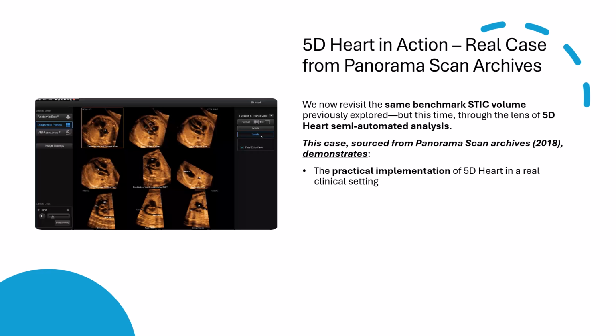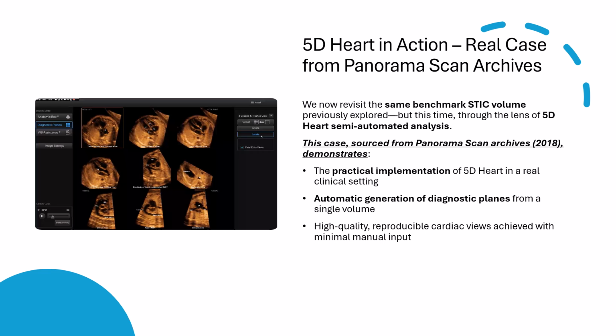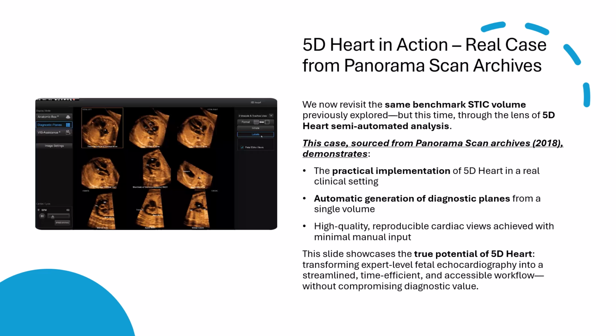5D Heart automatically generated all 9 diagnostic planes as recommended by the AIUM, and just like that, no labor intensive manipulation, no prolonged trial and error. The full spectrum of cardiac anatomy is laid out for review. This is not a simulated demo or a cherry-picked dataset. This is a real world fetal echocardiography performed in an actual clinical workflow, and it's a powerful demonstration of how automation can enhance consistency and efficiency without sacrificing diagnostic integrity.